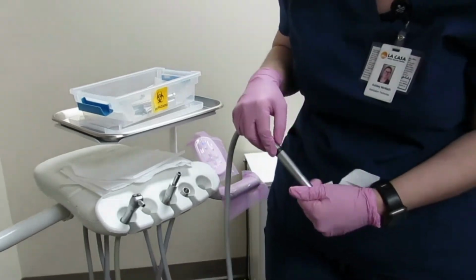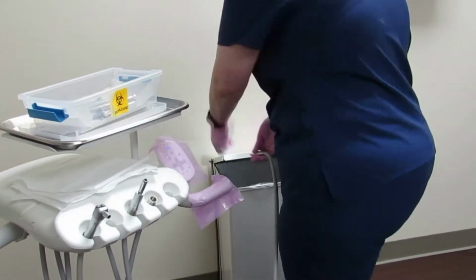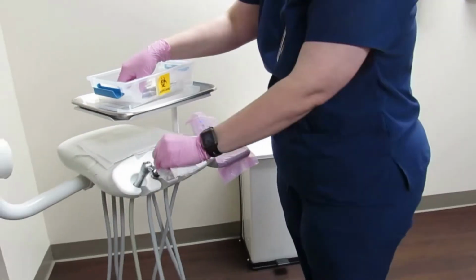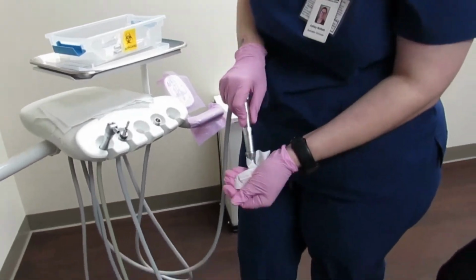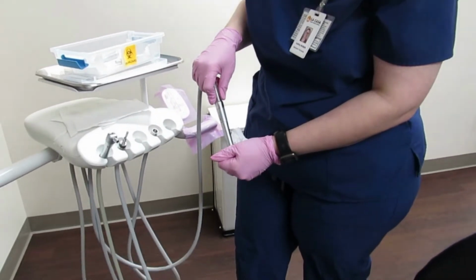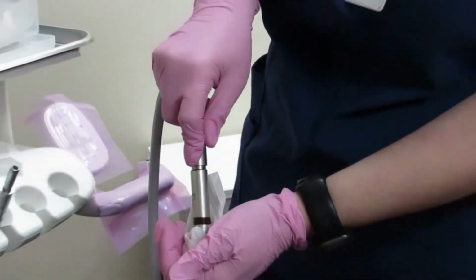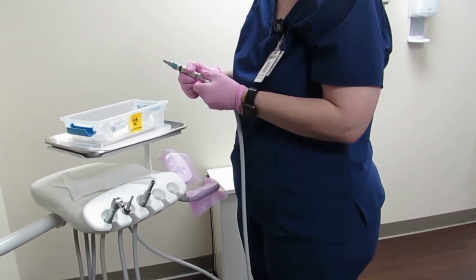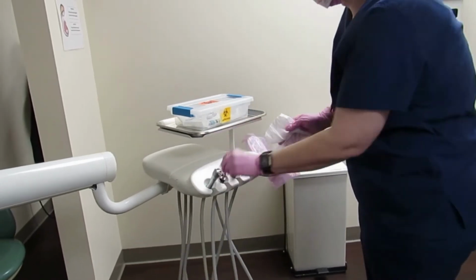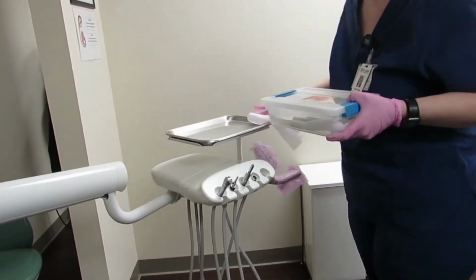Once in the operatory room, all handpieces will be purged for a minimum of 2 minutes. This will help expel any excess lubricant. After purging is done, the area that was used will be disinfected. Remember, cleaning and disinfecting all operatory surfaces is very critical.